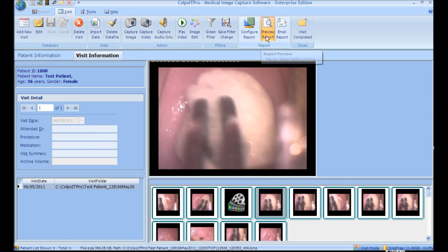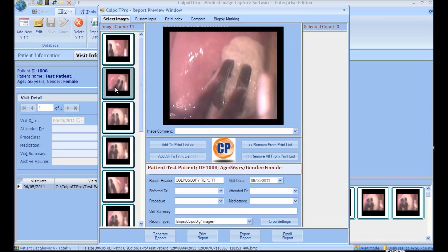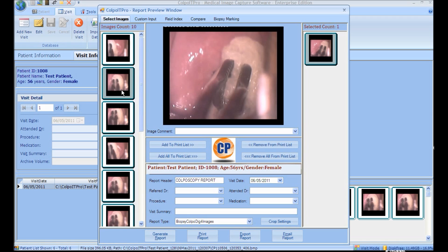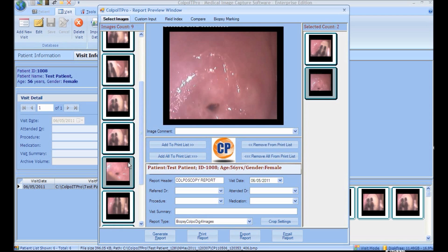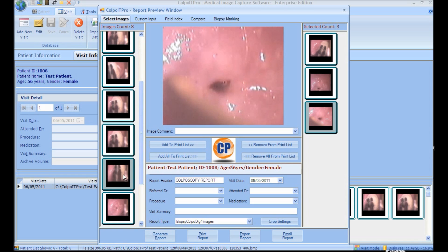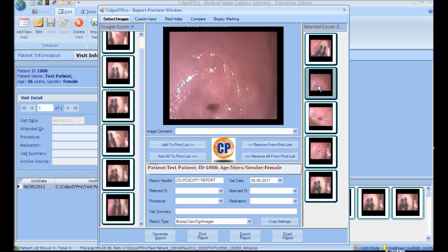For reporting, click the Preview Report button. The images taken will appear on the left-hand side, and on one click the image can be viewed. To select images for print, double-click on the images taken. A maximum of 18 images can be selected with a minimum of 1. To add an image comment, select the image from the select count. The comments are auto-fill generatable. Enter the other details to be mentioned on the report.